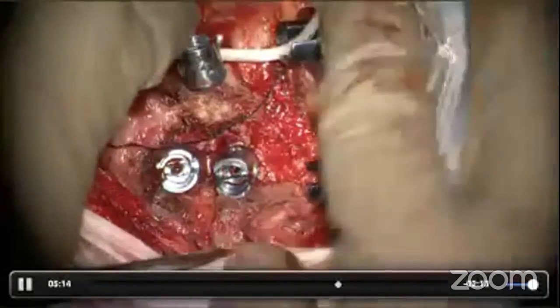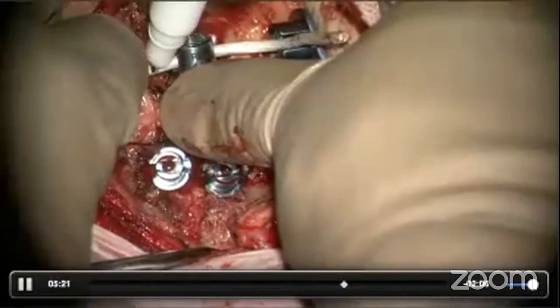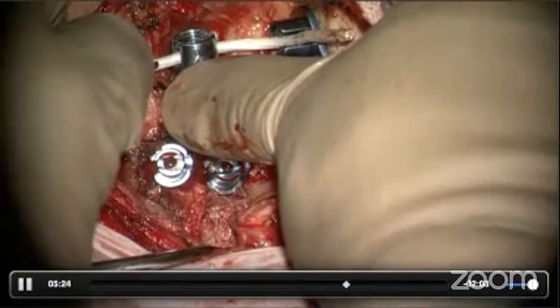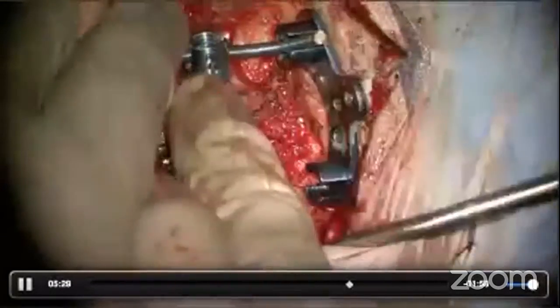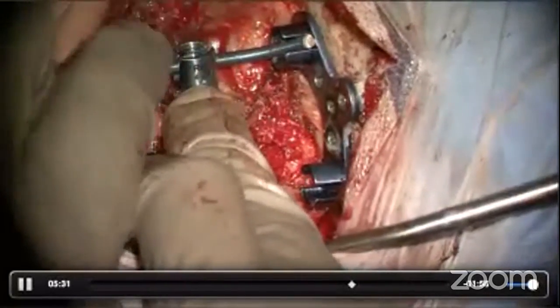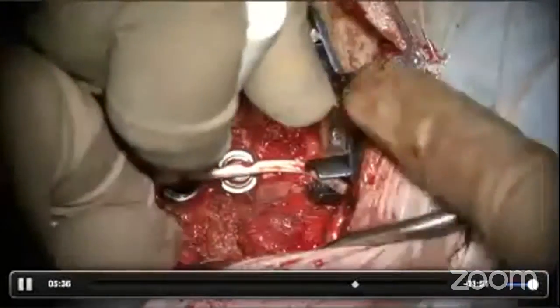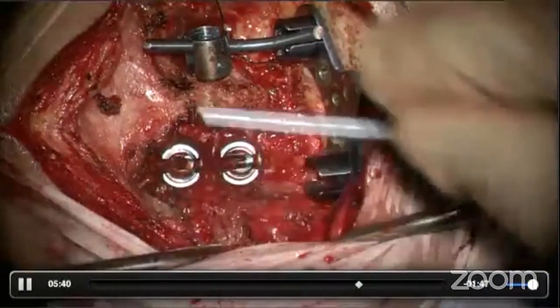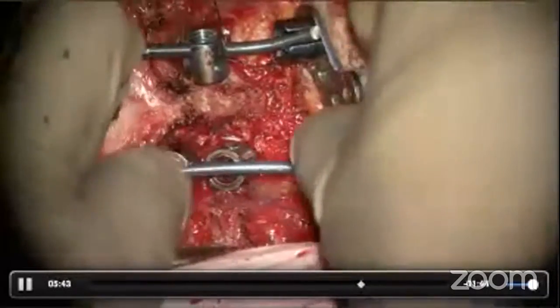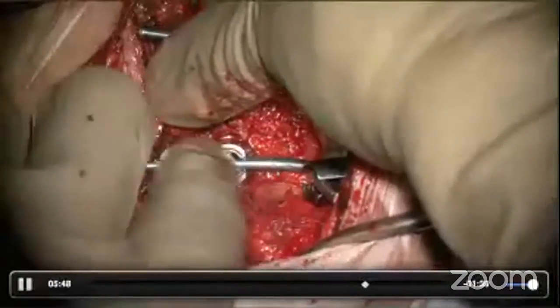Next, to contour the rods, I like to use a malleable aluminum rod. A significant angular bend is necessary at the OC junction. These rods are soft enough that they can be pushed into the screw to get a template for bending the rods. They can be sized accurately as well, like this. The final rod is contoured with in situ benders and it needs to be shaped exactly like the aluminum rod template. This avoids trial and error, as repeatedly bending and unbending the main rod will weaken its strength and notch it considerably.